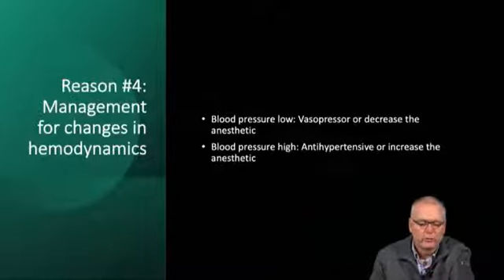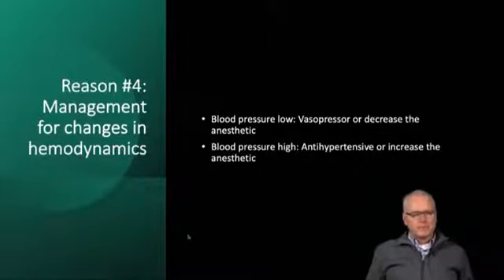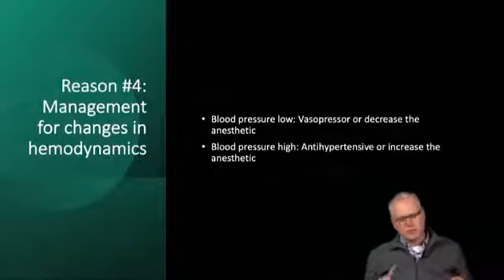Reason number 4, management for changes in hemodynamics. I'd like you to consider 2 clinical scenarios that you may encounter. One is the blood pressure is low. And without processed EEG monitoring, you have 2 possible things that are wrong.